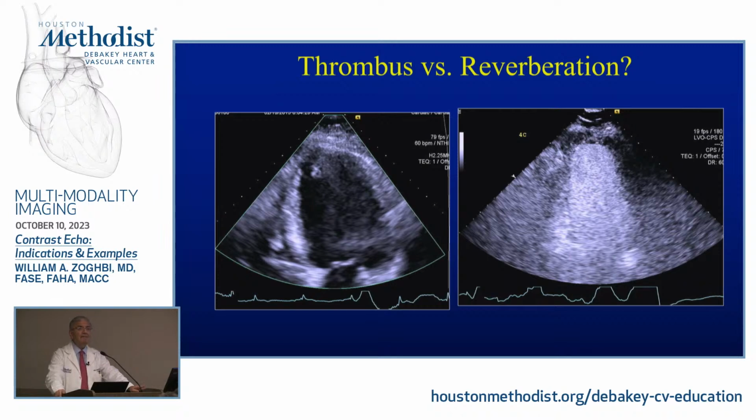All right. The other is change frequency. Change transducer, because many of these reverberations are because of the casing of the transducer itself. So you change frequency, view, etc. Right? To take a look at that. All right. Next case. If we have a next case.